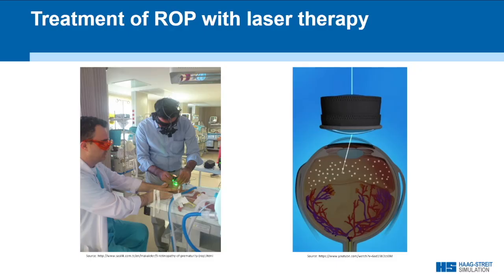And those laser spots have to have the correct amount of power, and they have to be placed sufficiently close to each other. Overlapping should be avoided, as it would damage the retina.